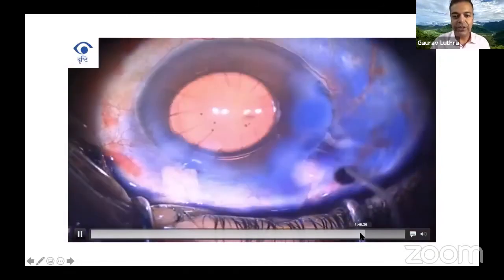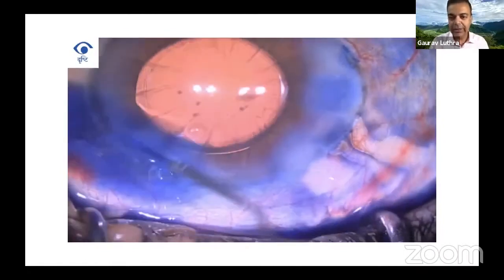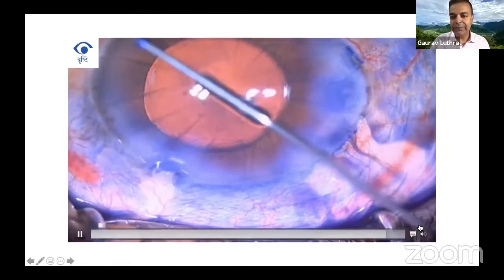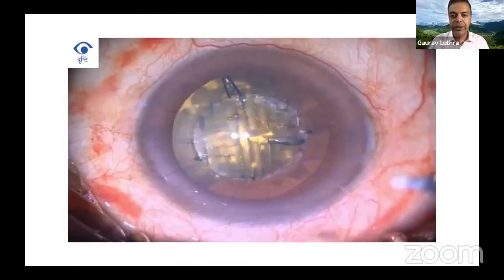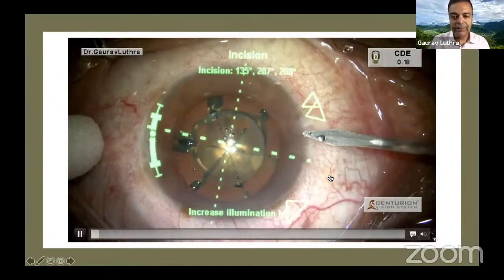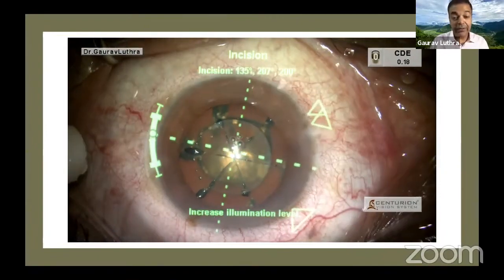Now, arc incisions, you can understand, are difficult to make, difficult to handle, and then difficult to close. But as you can see here, these incisions seal seamlessly, and I really enjoy making these incisions with my keratomes. So another situation where we are using femto assisted surgery, but using the Mani blades, which I prefer to use today. And we can reuse them a few times.